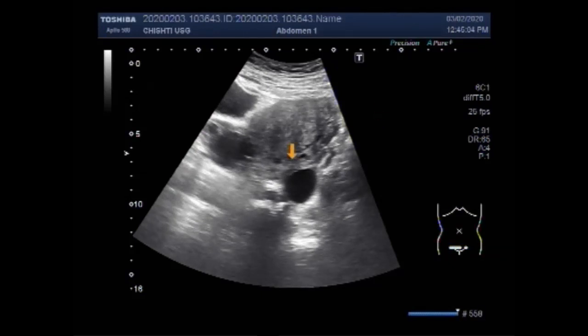You can see this is a small right ovarian cyst, and this is the left ovarian cyst.